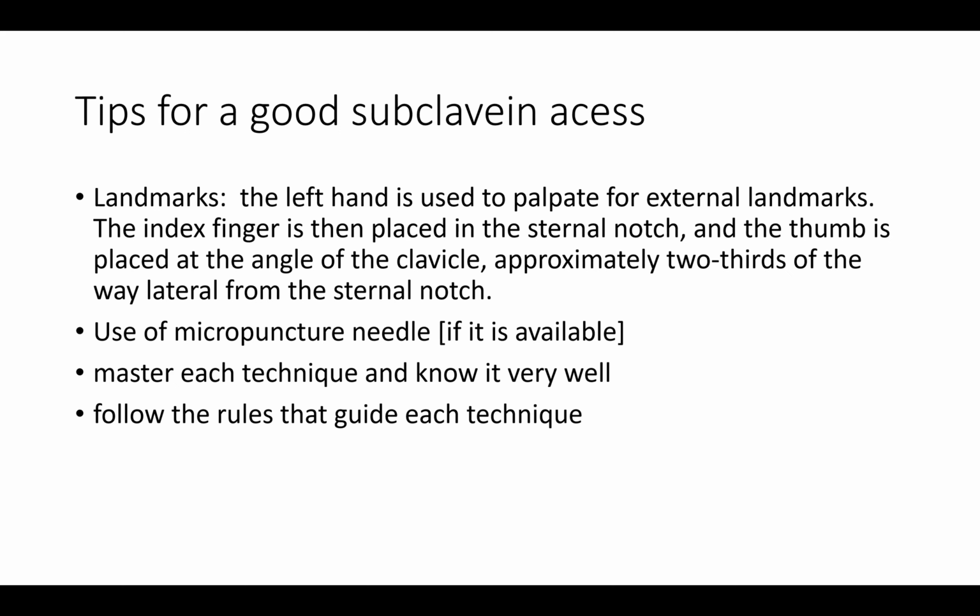Whether you are doing blind puncture, fluoroscopy guided puncture, or venogram directed puncture, you must use what we call micropuncture needles. I remember in Bayelsa, I used them a lot there because doctors usually bring them from the US.